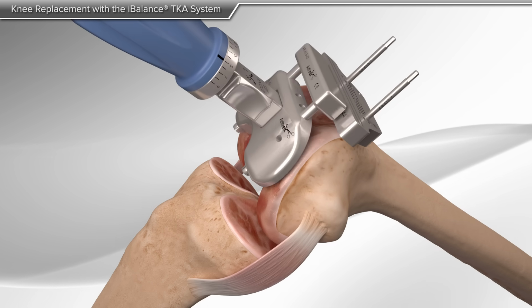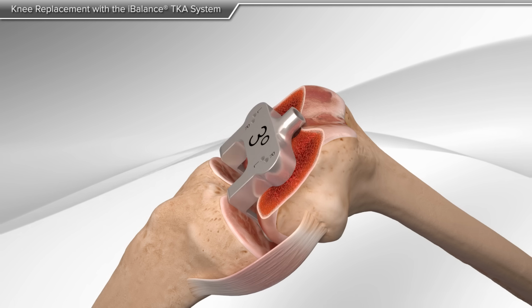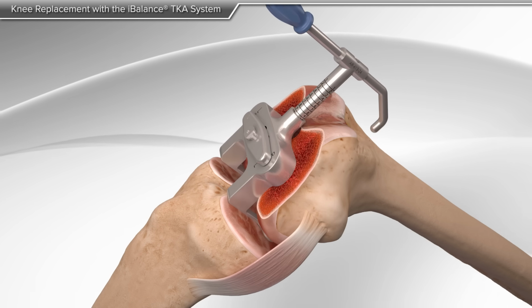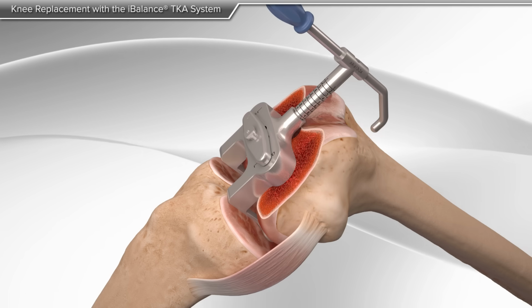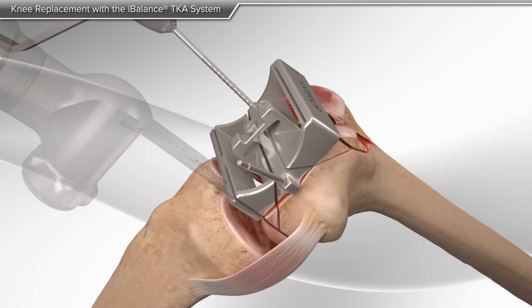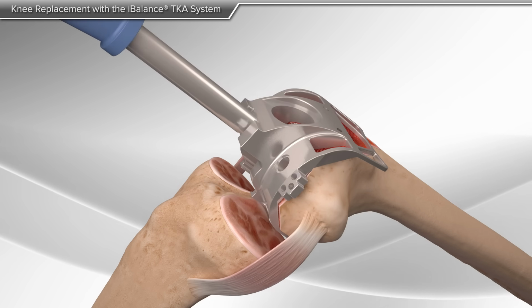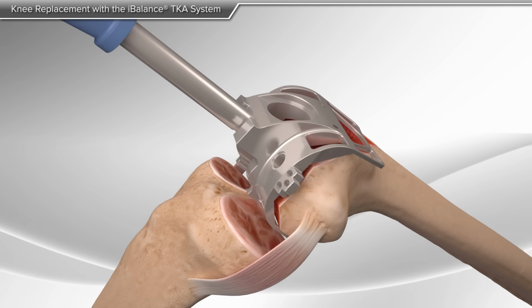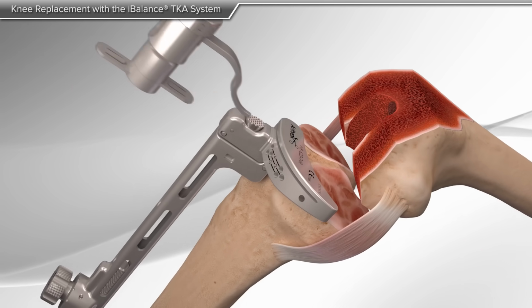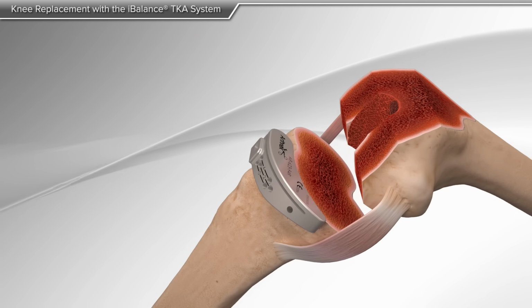During the surgery, your doctor uses a series of guides to help remove the damaged bone and prepare the femur, ensuring proper implant size and alignment. Next, your doctor will prepare the tibia using a series of guides to ensure proper implant size and alignment.